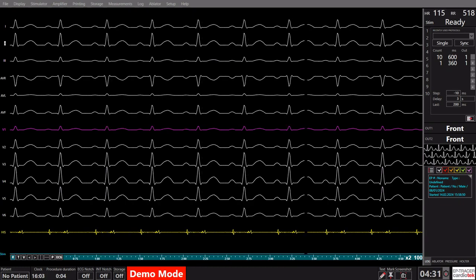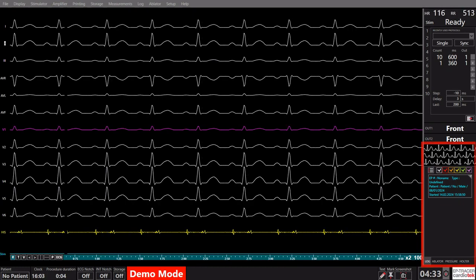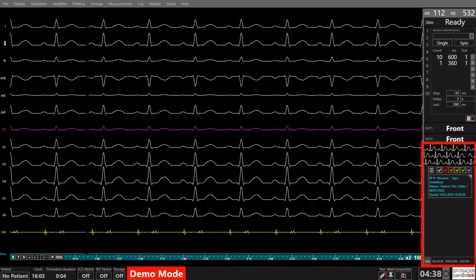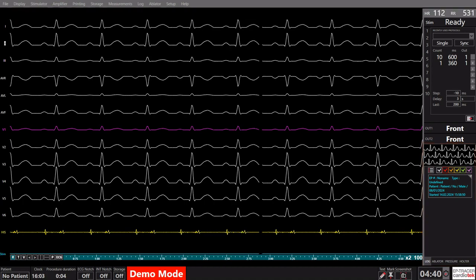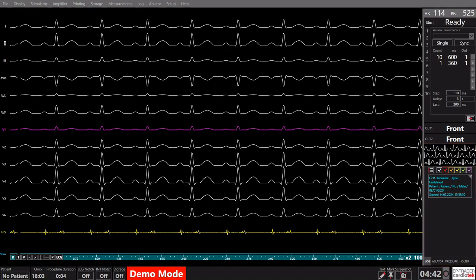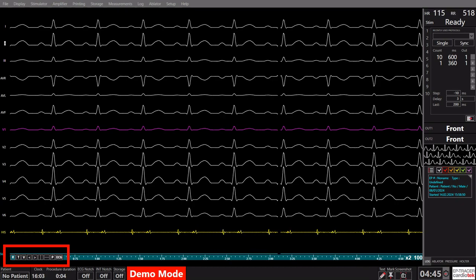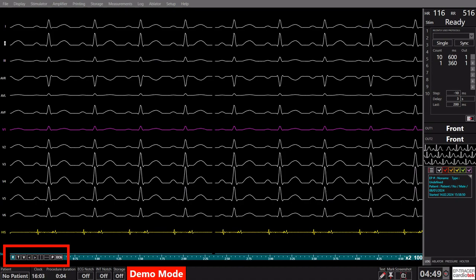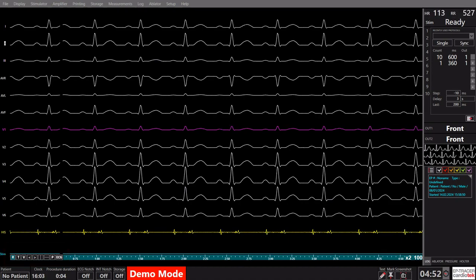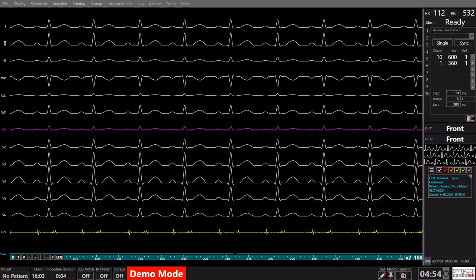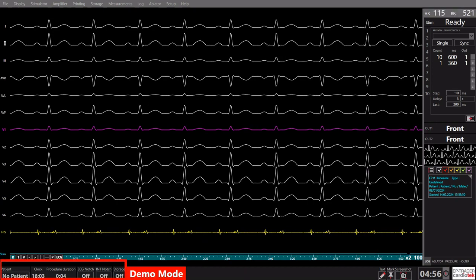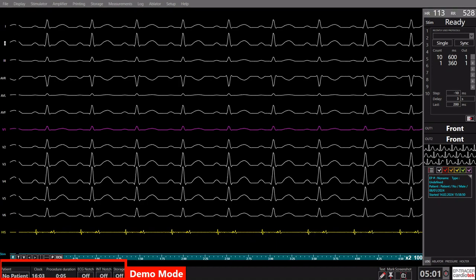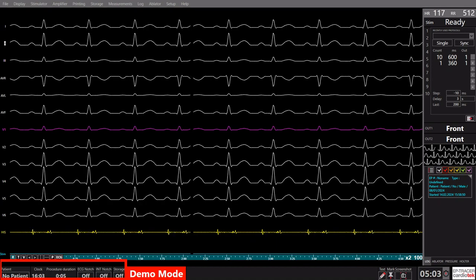Adjacent to the stimulator controls is the intervention log, providing a chronological record of the procedure for comprehensive documentation. Just below the signals, a range of visualization modes is available, enhancing flexibility and adaptability to various preferences. In the lower section of the screen, you'll discover the patient data displayed, along with toggles for notch filters and storage activation.